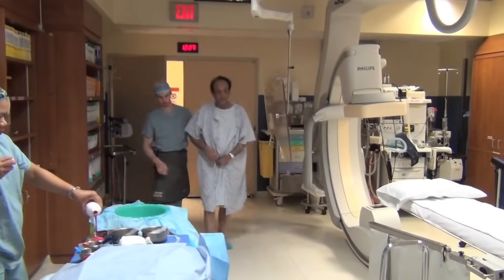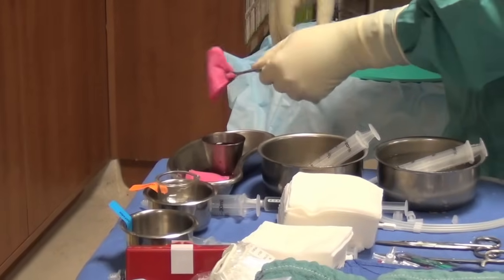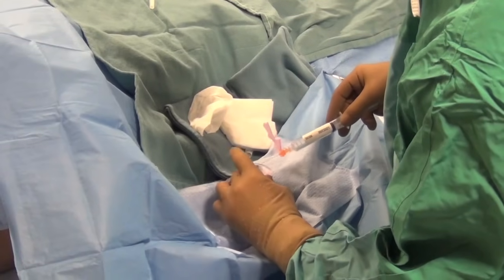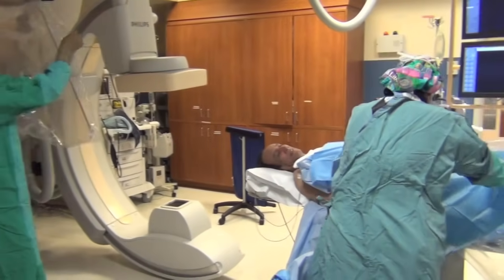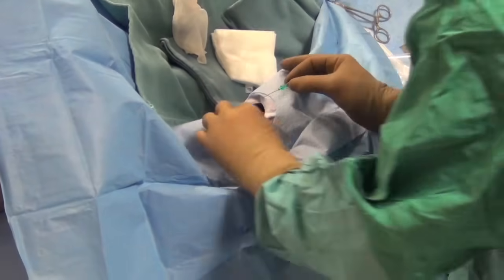Here you see Mr. Nazim coming into the procedure room and being led to the procedure table. The nurses will do some prep of the skin on the hand and at the top of the leg, and then we usually insert some local anesthetic — a very small amount, a little bit of discomfort with that — but once it's numbed up, you usually don't feel anything else. You are awake during this procedure. We often use some mild sedation so you're a bit relaxed, but we do not need a general anesthetic. In fact, many patients can watch on the monitor exactly what's going on.